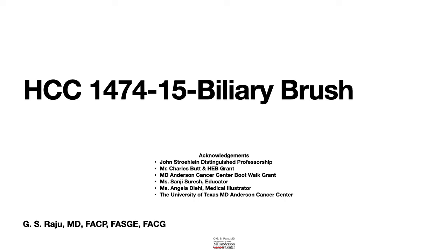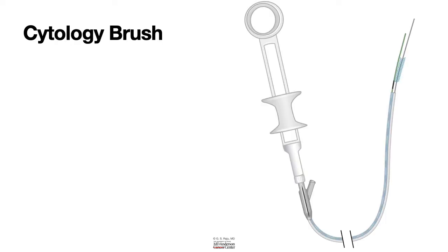Greetings. Let us learn about biliary brush catheter, otherwise known as cytology brush.